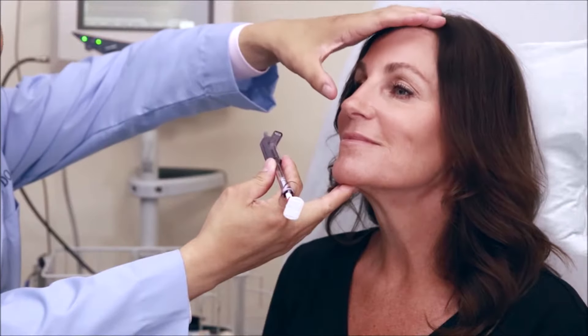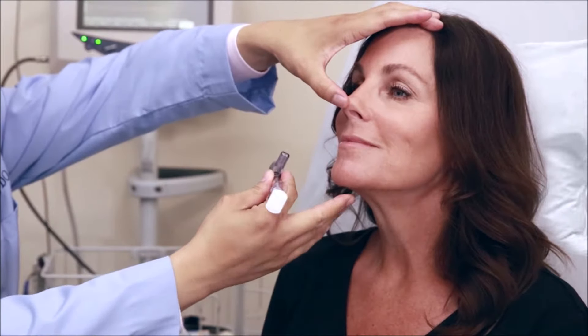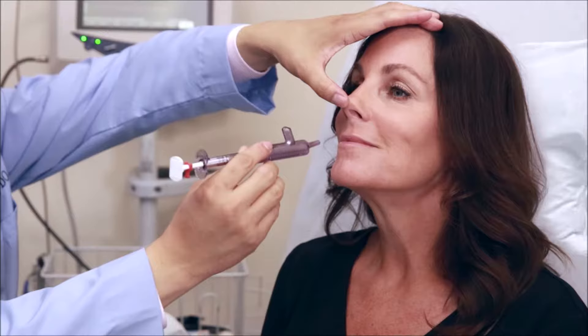Using your non-dominant hand, gently lift the tip of the nose of your patient to expose the entrance of the nasal cavity as shown here.